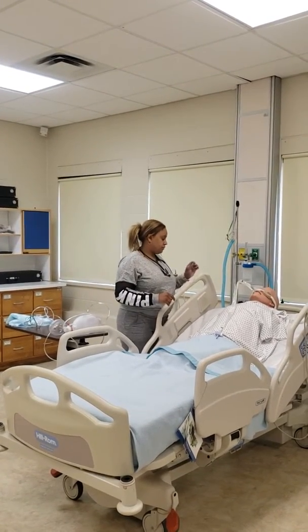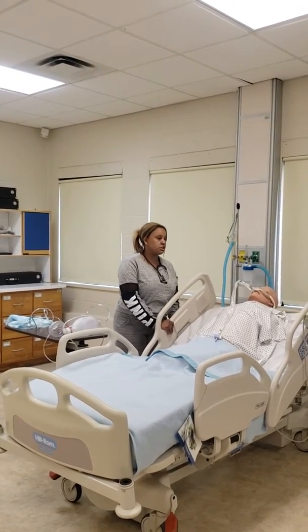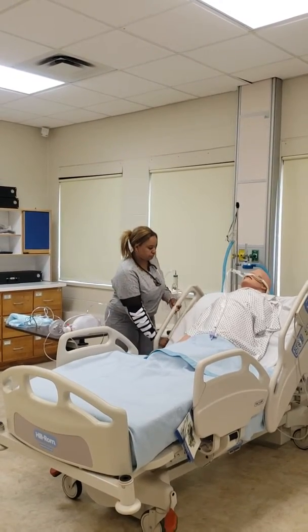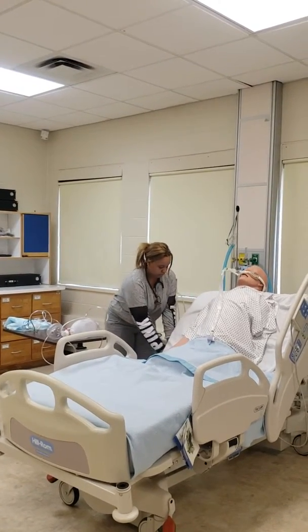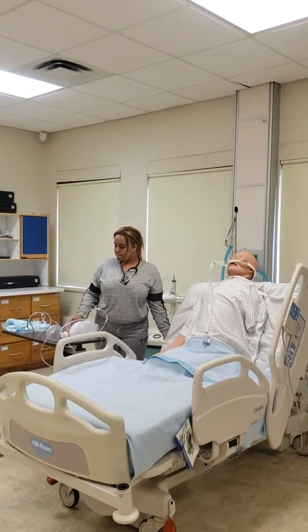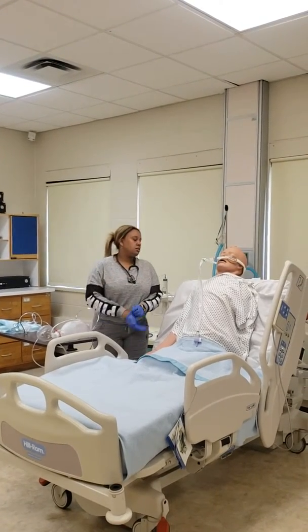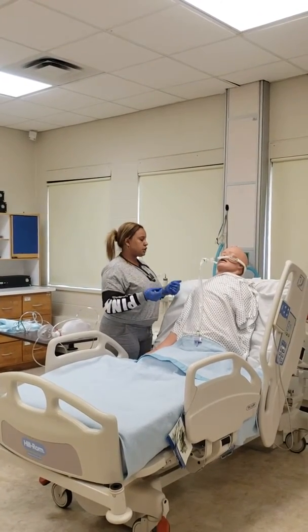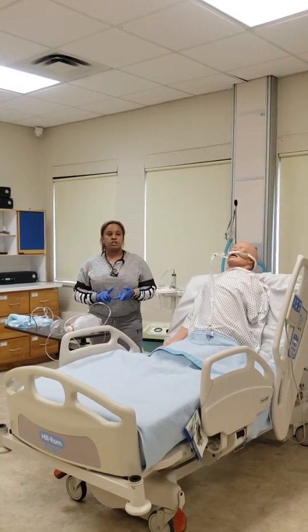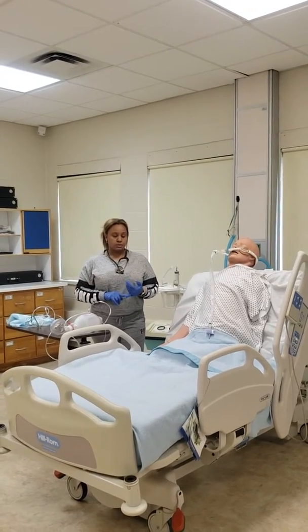Okay. I am now going to place the patient in a high Fowler's position, and that is 90 degrees. While the patient's in 90 degrees, I will check the patient's breath sounds, heart rate, saturations, blood pressure, respirations, and color.